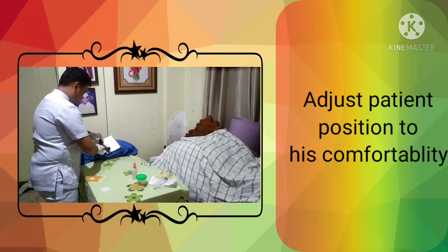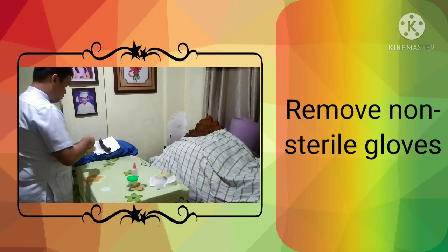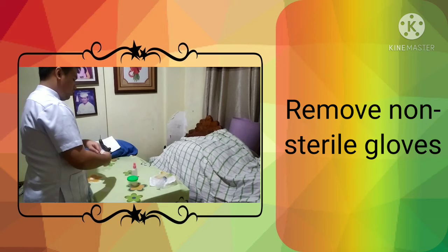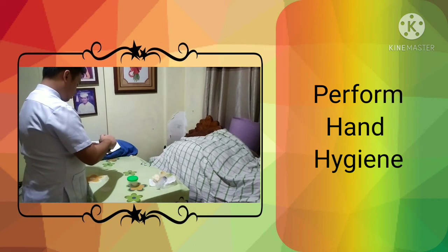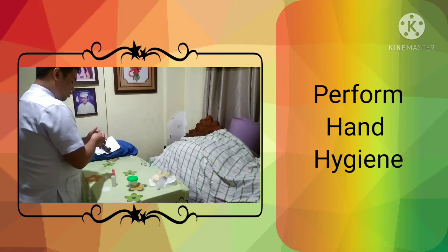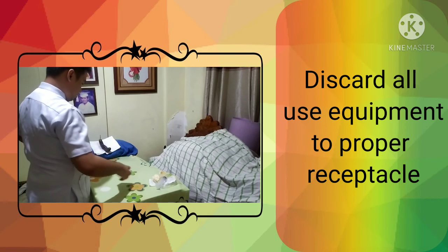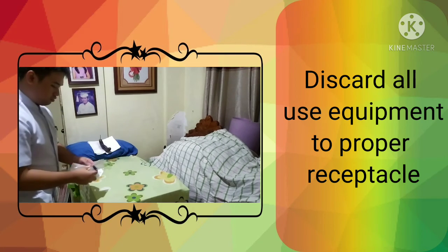Adjust patient position to his comfort. Remove the non-sterile gloves. Perform hand hygiene. Discard and dispose all used equipment to the proper receptacle.